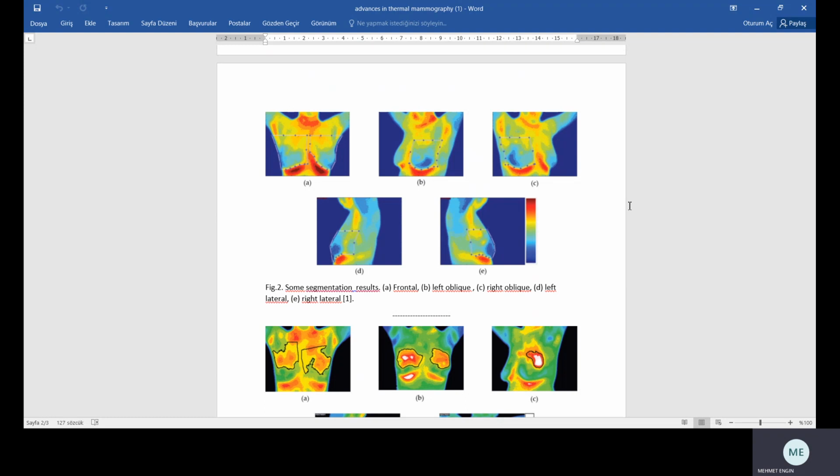The heat patterns found in the thermal images are then analyzed for specific tumor properties. Tumor-specific patterns include multiple important thermal patterns or features that typically help in discriminating malignancy versus benign conditions.